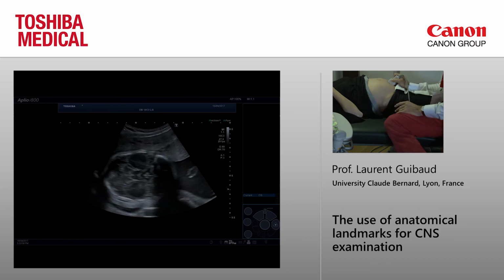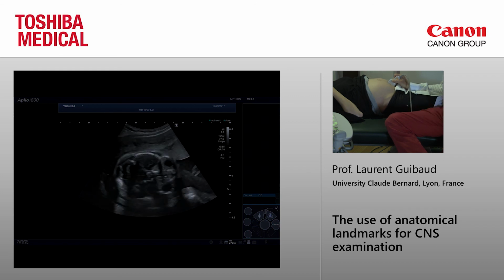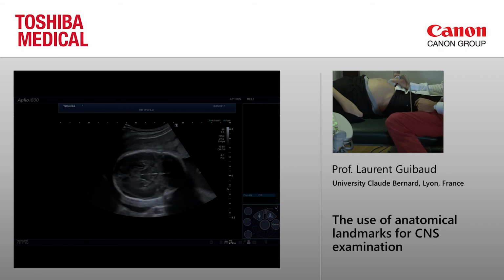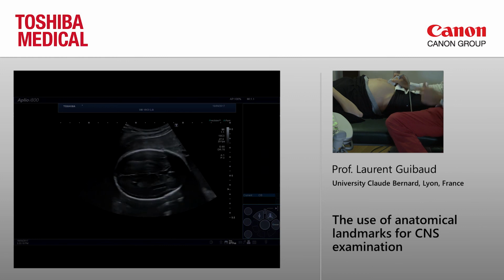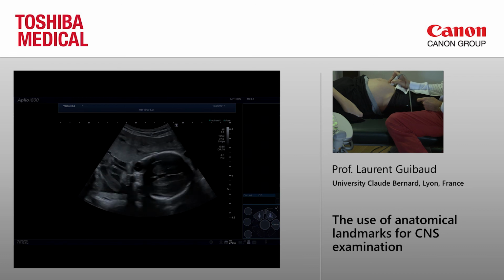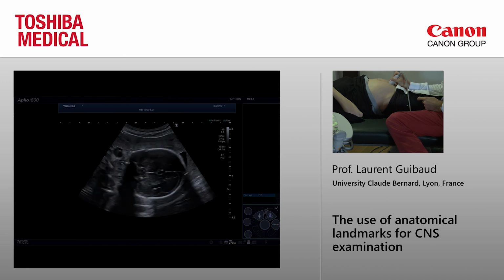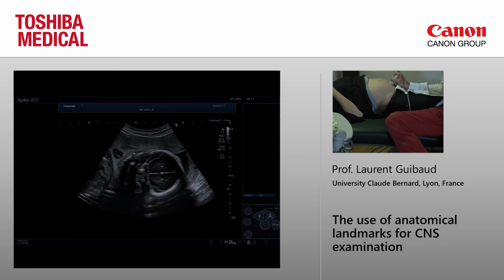And just to show you something, you see, when I do my scanning, I look at you, but I don't have to look at the screen or the patient. And you see, the midline is really orthogonal. Okay. So when I do that, I have just to turn my hand like this, and if I do that, I will be on the coronal view. Okay. So you have my hand here.